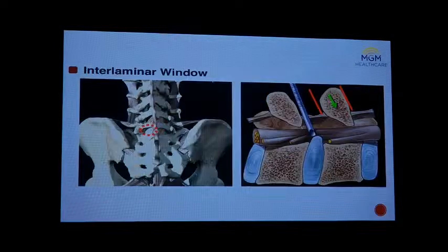And in high risk situations, what we do is we put the patient under conscious sedation. We not only have the advantage of seeing things, we also get feedback from the patient on whether he's got relief of pain on the table, and that's the plus. When you have multiple discs, you are trying to find out with nerve root blocks. You localize it, and then you take the patient up on the table and check after removing the disc. I also ask them to do a straight leg raise by dropping the legs down, and a McKenzie extension to see if they have got relief of pain. After visually confirming and also getting the inputs, we conclude that the mission is accomplished.